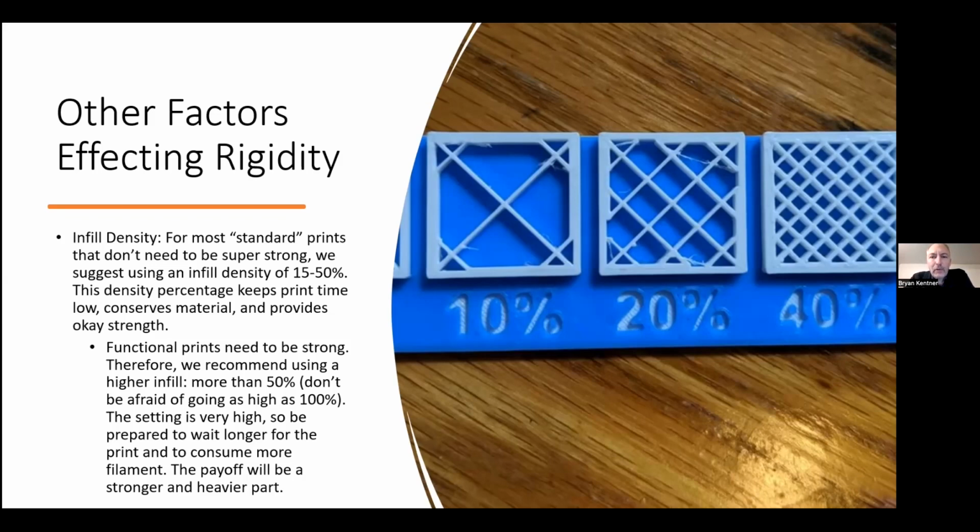There are also different types of TPU. You have the number afterward, which is like their standard durometer. So you have like an 87, a 93, or a 95. That's how firm that material is. So you can change that a little bit also just by changing the material. If you printed something in an 87 versus a 95, it's going to vary how squishy that insole is. But you need to play a little bit if you're going to be doing different materials that are outside what your manufacturer recommends.